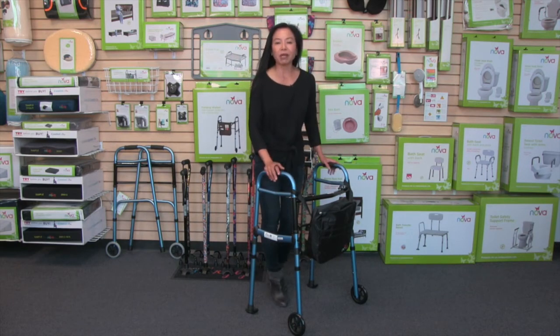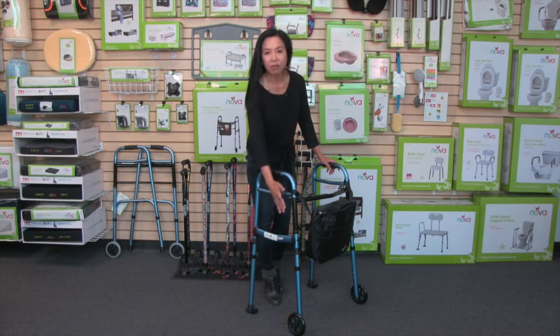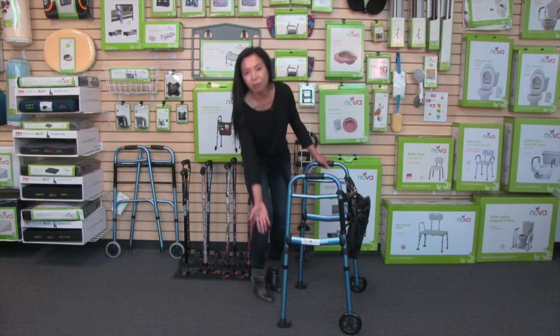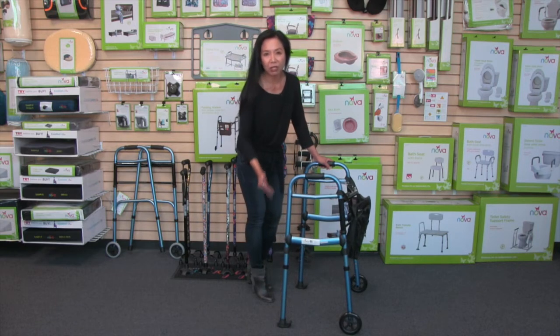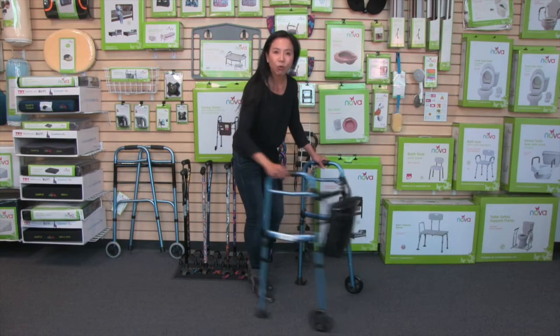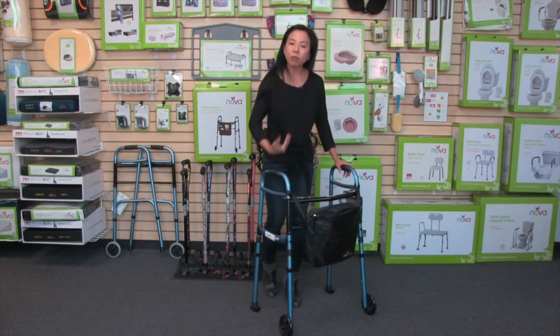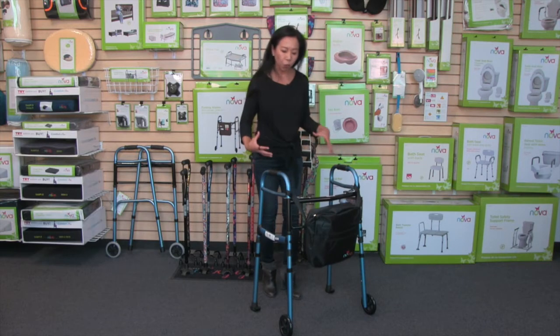I love this walker because it moves so well. Not only does it have the front 5-inch wheels, but it comes complete with the walker glide skis — no tennis balls here. That is so important in helping this walker glide and move, making mobility so much easier for the user.